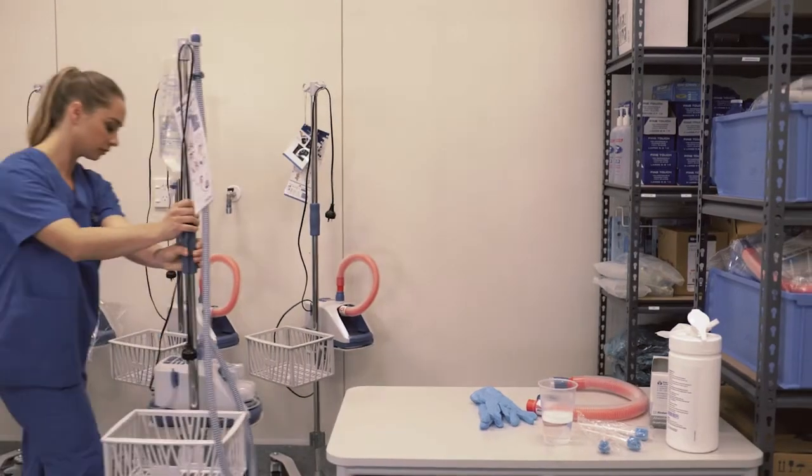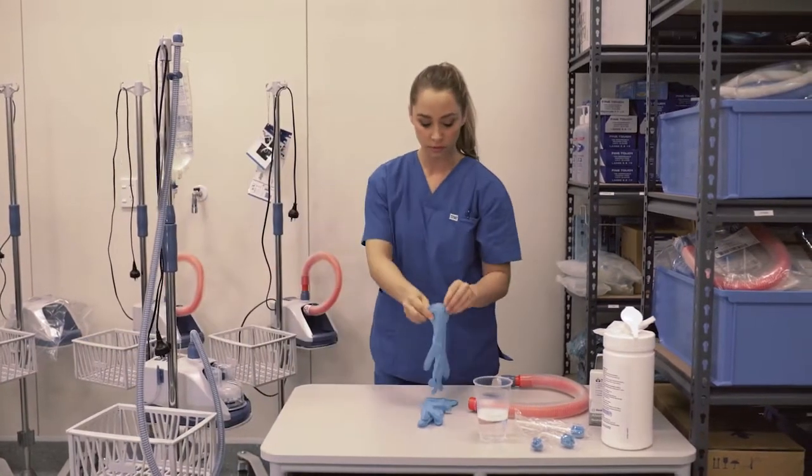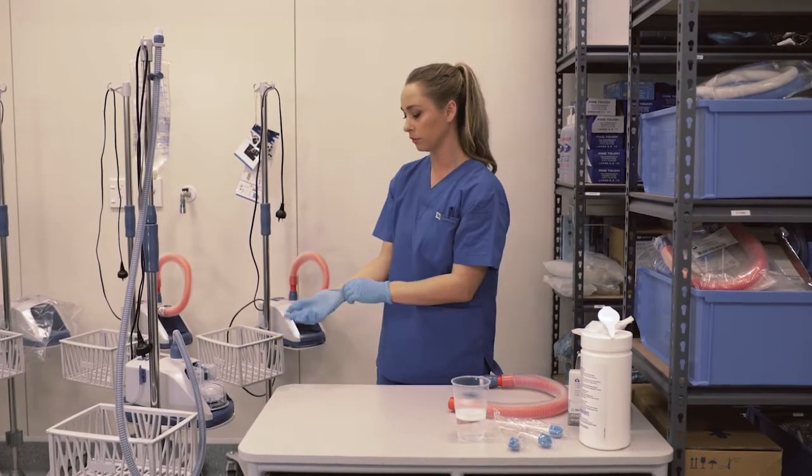These steps must be carried out between patients: cleaning, high-level disinfection, and storage. Cleaning is particularly important. You need to remove debris so that disinfection works effectively.